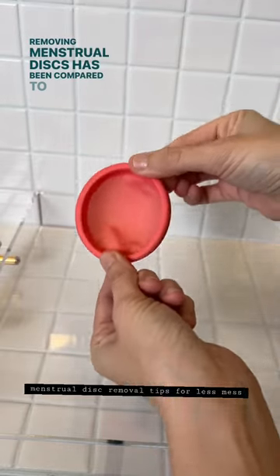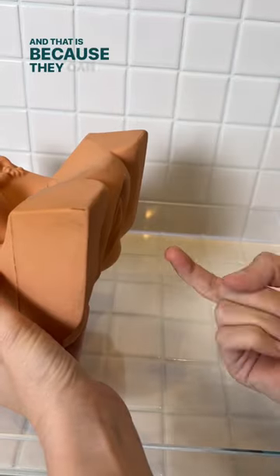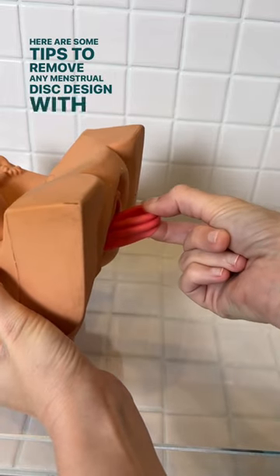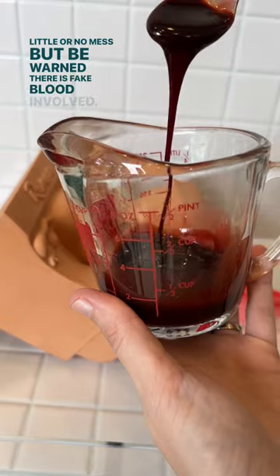Removing menstrual discs has been compared to a blood drawer, and that is because they can be messy to remove. Here are some tips to remove any menstrual disc design with little or no mess, but be warned there is fake blood involved.